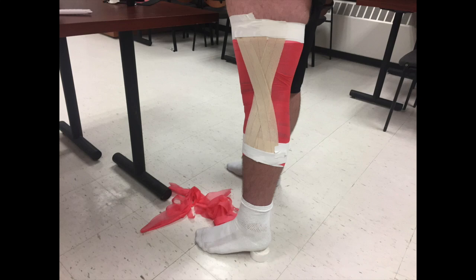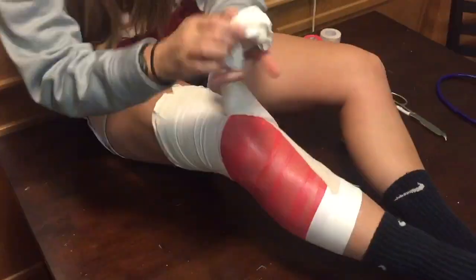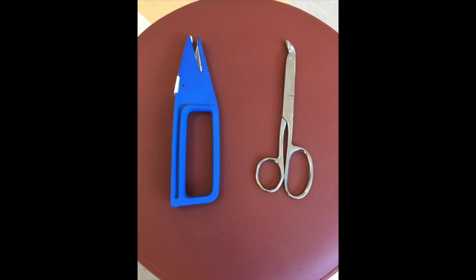This is what an LCL taping application would look like right before closing with StregiTape. One way to remove this tape is by unwrapping it. Some other ways to remove this application are by using a shark, which is on the left, or scissors, which is on the right. You would cut down the side of the application going from proximal to distal.